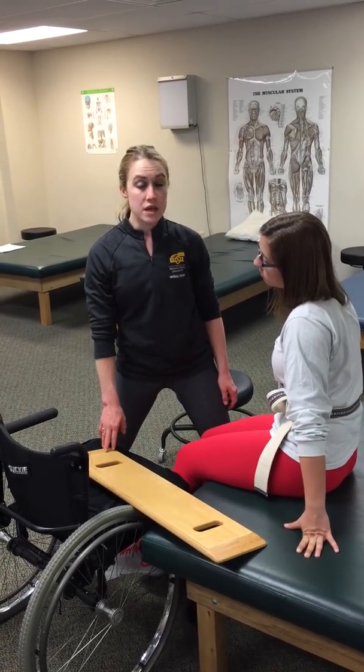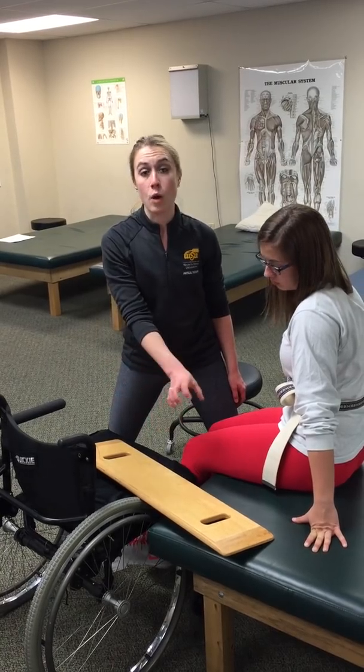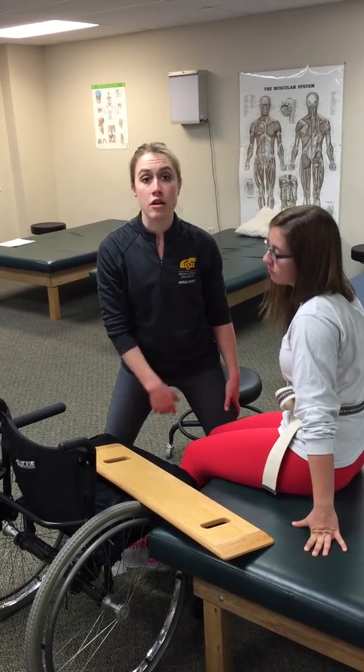board. Where this becomes really important is if you've got someone who's larger, you want to make sure that they are well positioned on that board so they don't go sliding off on the floor.